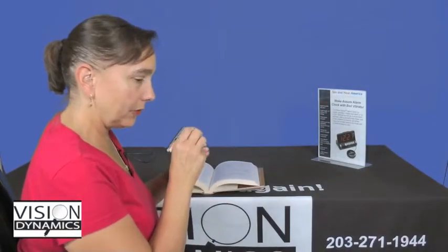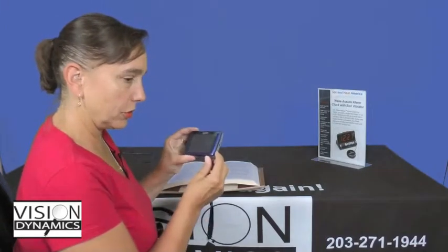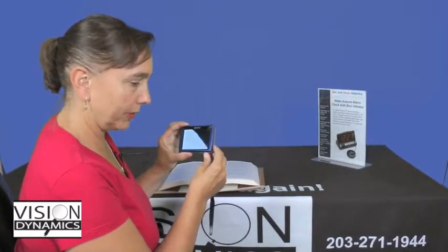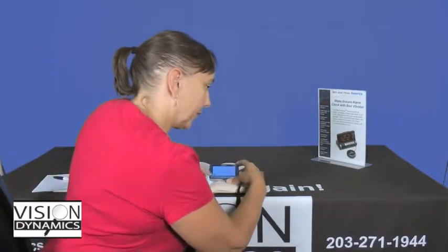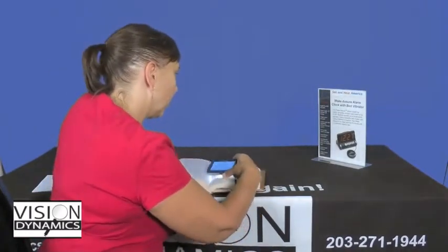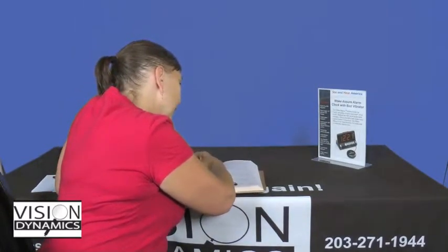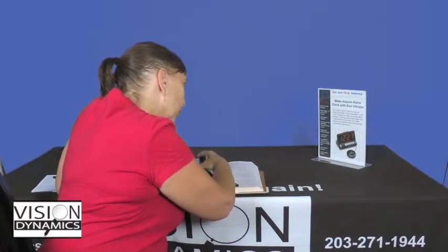Okay, so I've just swung my stand out. I'm going to turn my Mini on. That's on the right-hand side, just above the wristlet. And I'm going to place it down on my book. And I can go right up to the top here and go along and see the print.